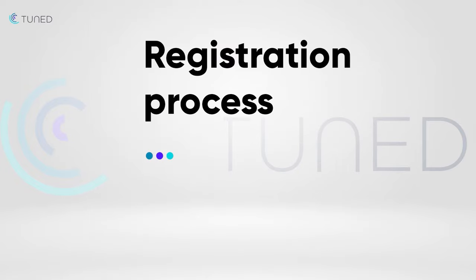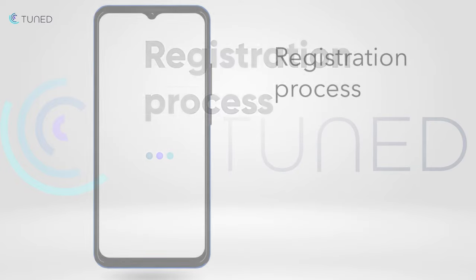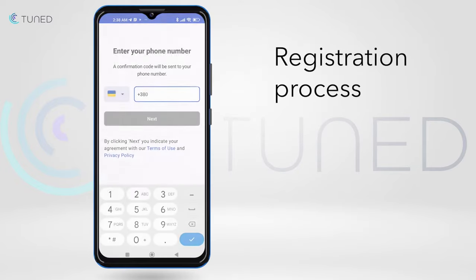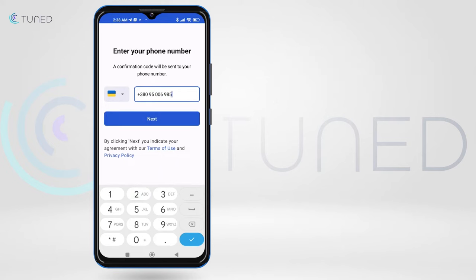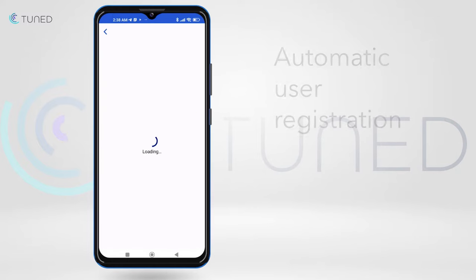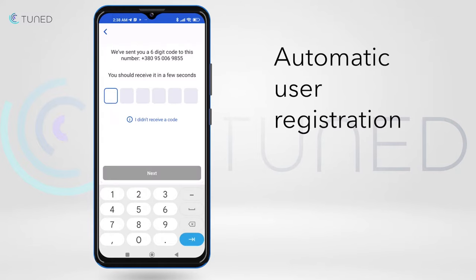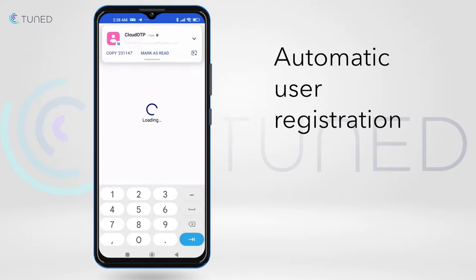First, we'll start with the registration process. This app requires the user's phone number in order to register the hearing aid to a specific user. The user types in their number and an automatic text message registers the user to the app.